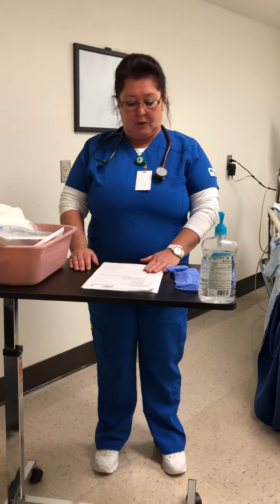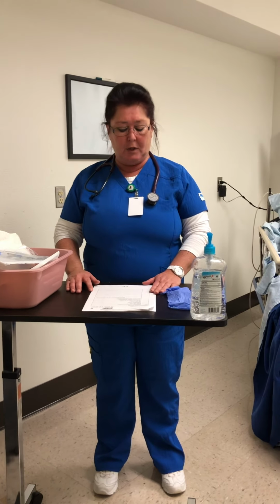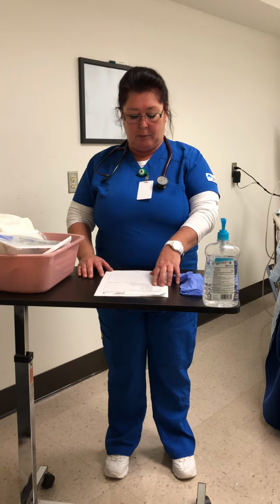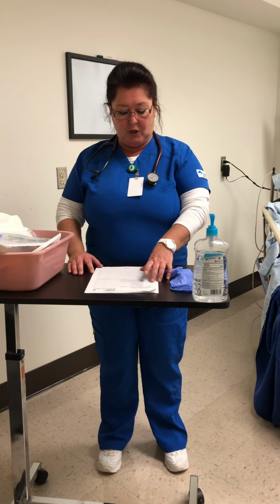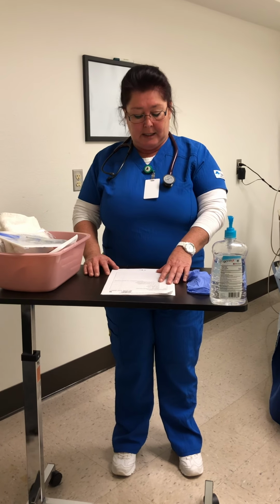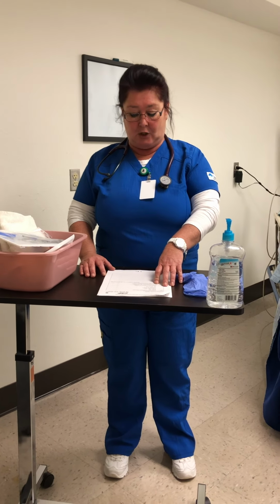So I have got the doctor's orders. It is for Shirley Cost, 5/14/1964. She has been admitted to med-surg for a small bowel obstruction. The doctor has ordered ultrasound of an abdomen at the bedside, insert NG tube for gastric decompression, an x-ray of the abdomen after the NG tube insertion, and attach the NG tube to a low intermittent suction.